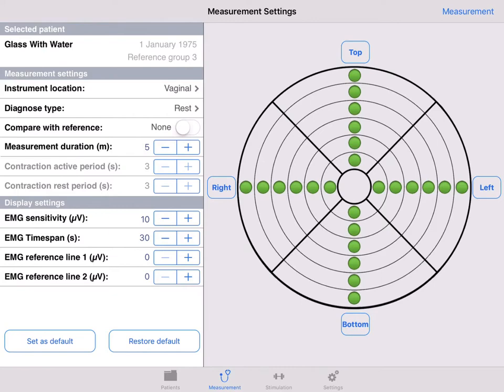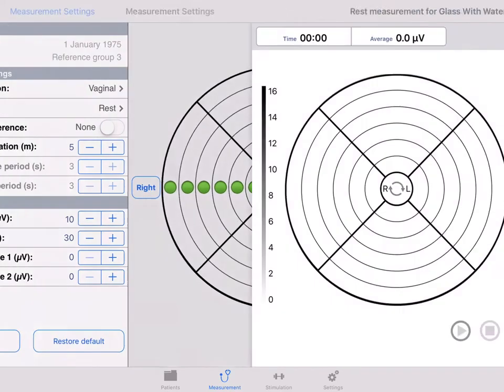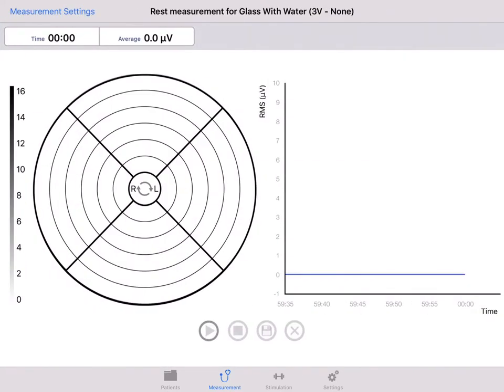Press measurement on the top right. You see the type of measurement, patient name, reference group, and comparison none or average on the top of the screen.